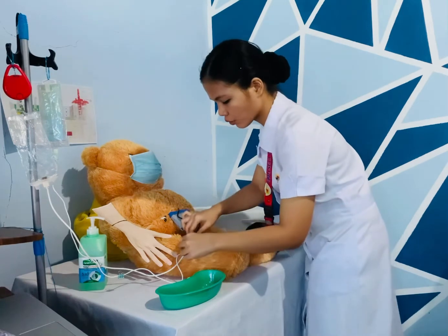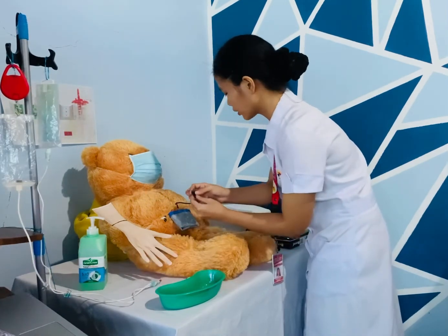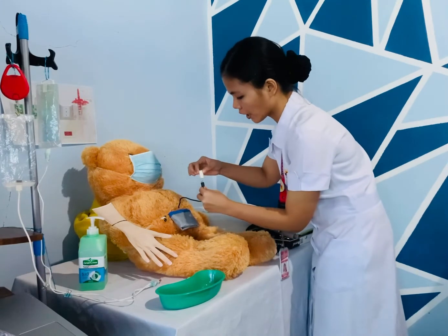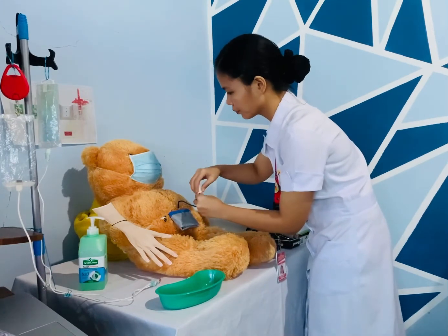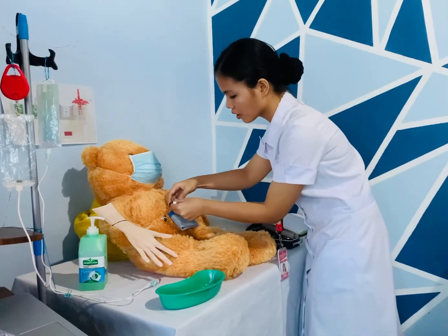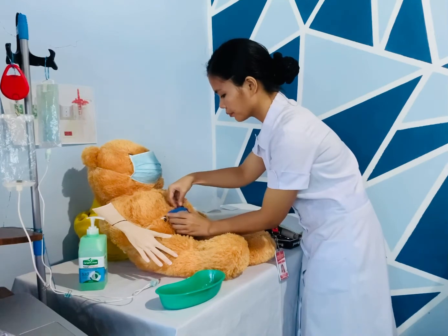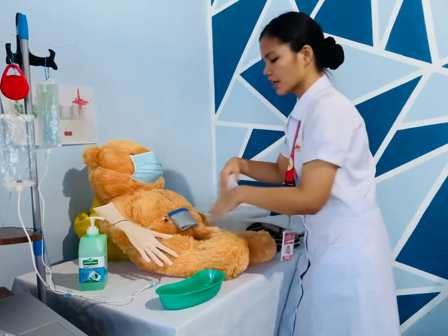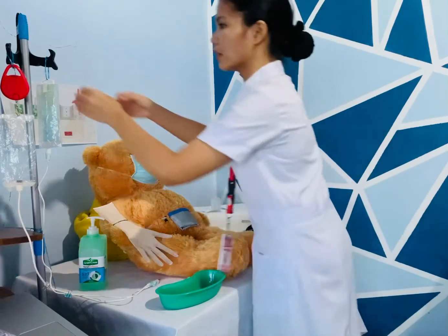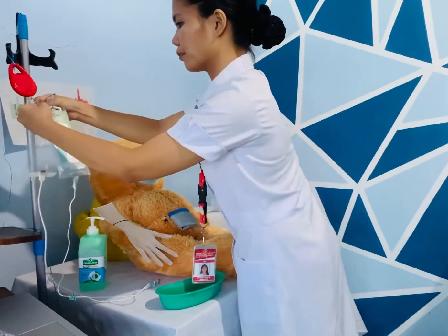Remove the patient connector from the transfer set. Then, close the transfer set with the new mini cup securely. Then, I will now put the transfer set back into the patient's waist pouch. Okay, then next is to empty the contents in the drain bag and flush it down the toilet.